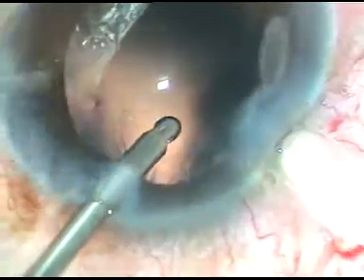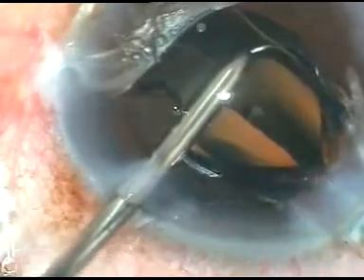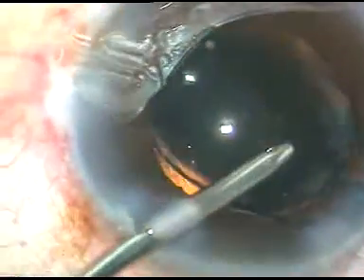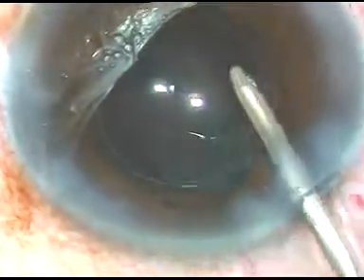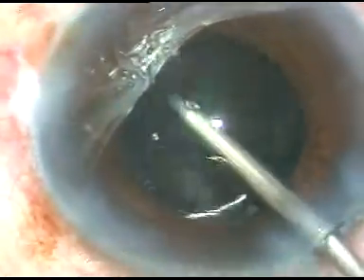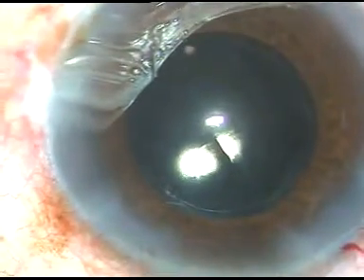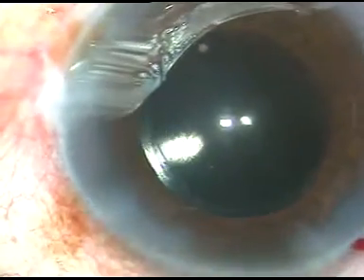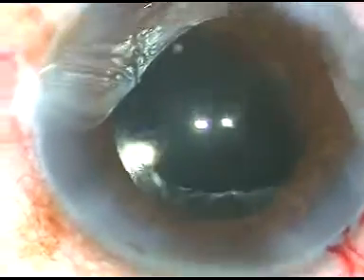The IOL is implanted under irrigation. The leading haptic goes into the capsular bag, and the trailing haptic is pushed into the capsular bag by the left-hand instrument — the irrigating probe. The irrigating probe then comes to the main port immediately and dials the lens while irrigation is on. There is no viscoelastic substance, so we have saved the time to remove it, and the viscoelastic substance can be used for another case.